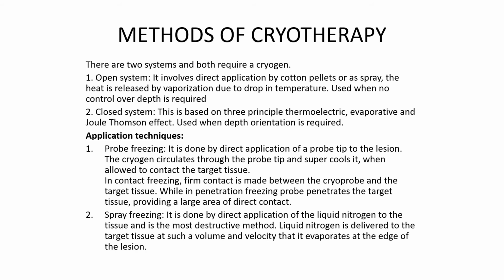أول واحد اللي هو open system. It involves direct application by cotton pellets or a spray. The heat is released by vaporization due to drop in temperature. تستخدم when no control over depth is required.